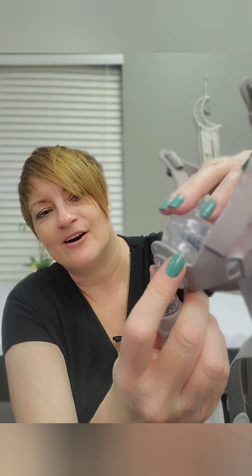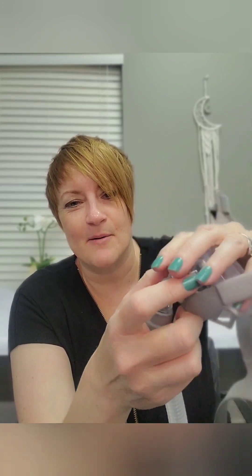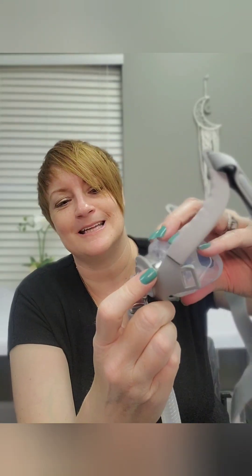One thing I noticed when you snap it back on — listen to that. A nice, satisfying snap. Almost none of the masks on the market snap when you put them together, but with this one you know it's together.